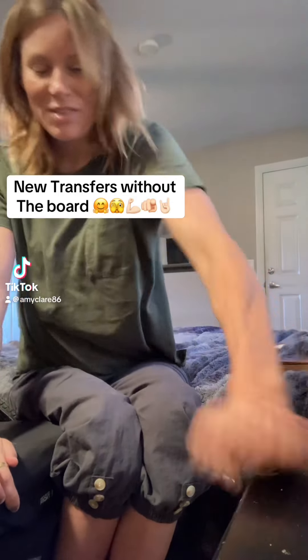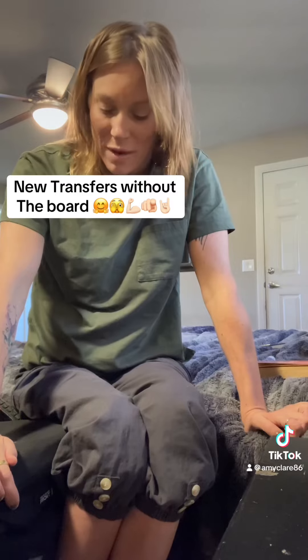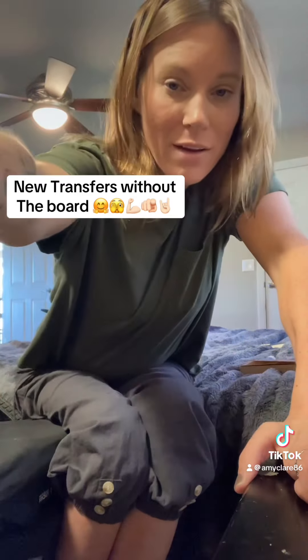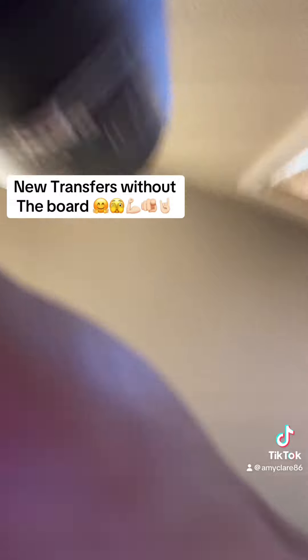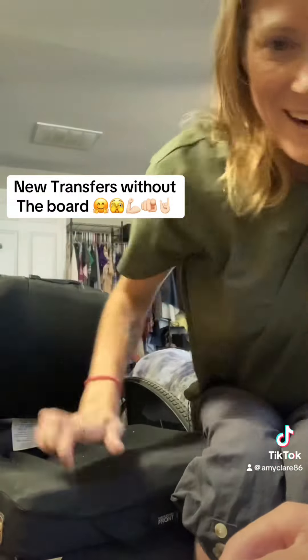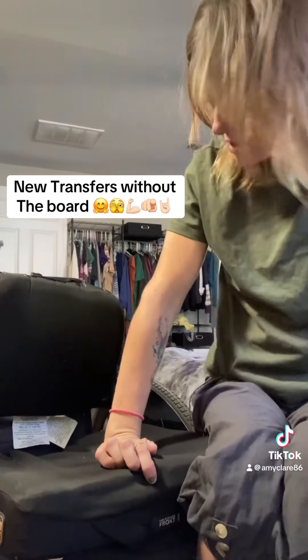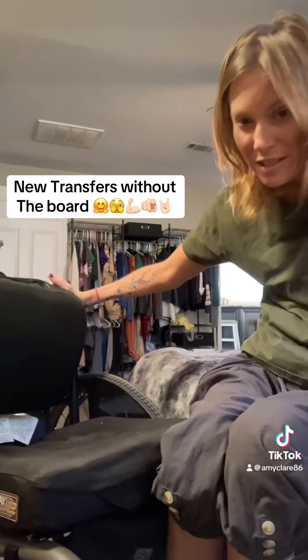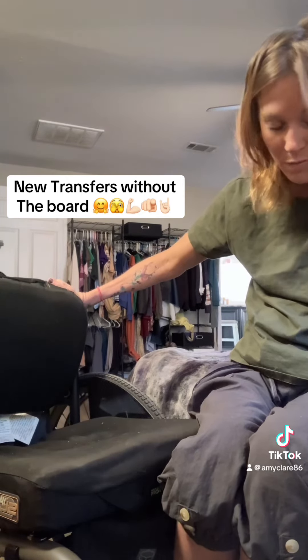I just started transferring a lot without my transfer board onto the bed. Let me get a better angle so you can see the chair and everything. I keep both feet on the footrest for support and to push on, and I have one arm on the side.